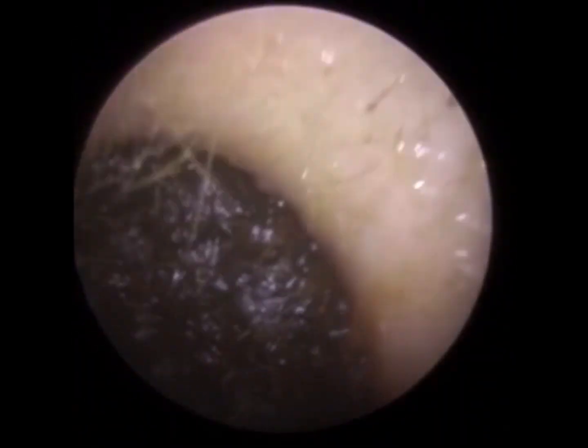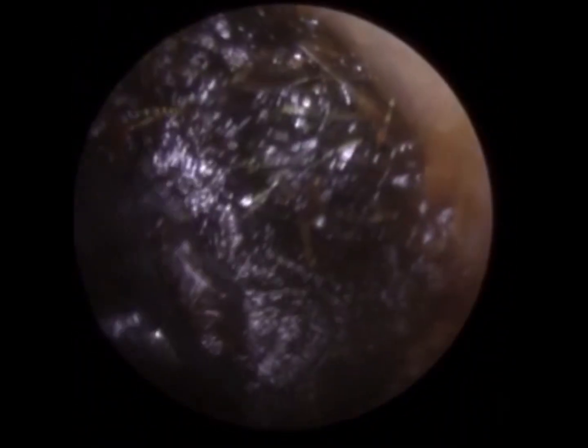And you'll see at the end of the procedure, there's a bit of blistering at the base of the ear canal. No active bleeding, it was just blistering, and it could have been we made contact with the base of the ear canal. I feel it's more to do when we remove this piece of wax, and there's a few skin adhesions, and those skin adhesions, as we elevated it off the base of the ear canal, it just caused a bit of mild bruising, blistering, but there's no active bleeding. You can see the wax here is a bit firmer and drier compared to the rest. It's a bit softer elsewhere.